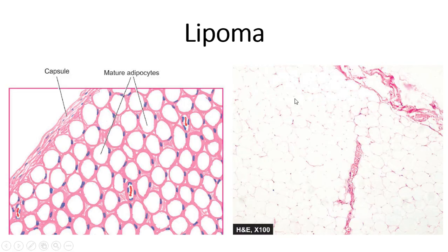Well-differentiated means the shape of the tumor cells is similar to the normal cells, and there are clear borders with the connective tissue around the tumor. So usually this characterizes a benign tumor.